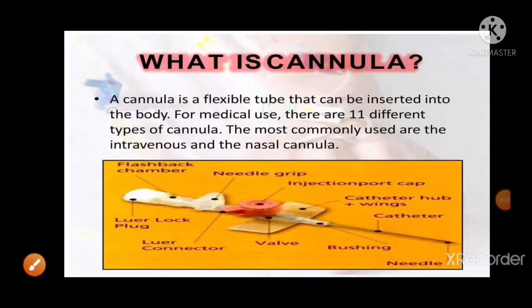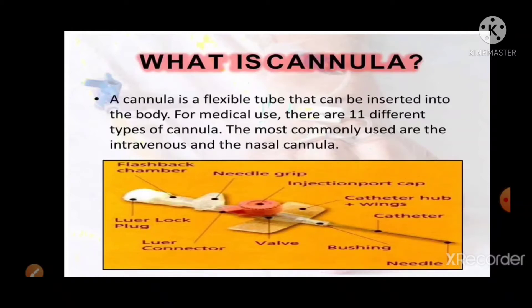Hello, welcome. I am going to explain about cannula. A cannula is a flexible tube that can be inserted into the body for medical use. It is a thin tube inserted into a vein or body cavity to administer medications, drain fluid, or insert a surgical instrument.